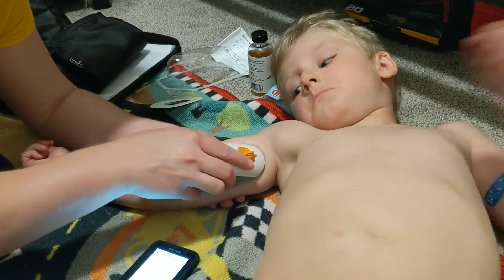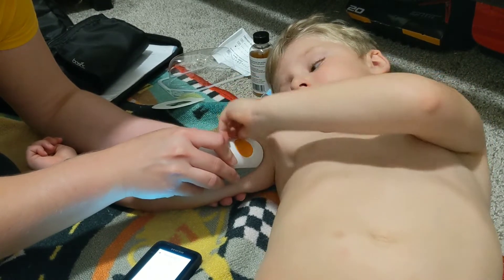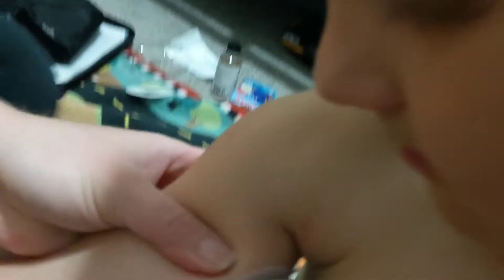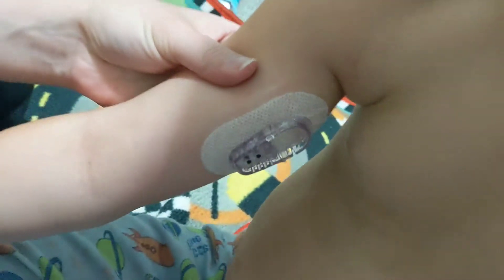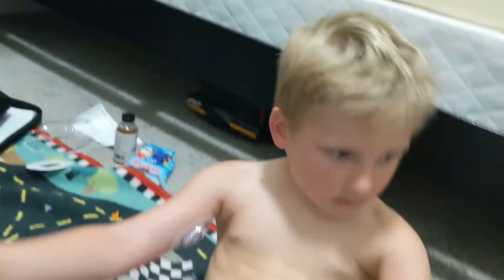Put the sensor down where you applied the skin tack. Riker likes to break off the orange part. Pull it up and pinch his skin — it's important to see the little tent you've created. Then Riker pushes the button and off it goes. It does hurt a little sometimes.